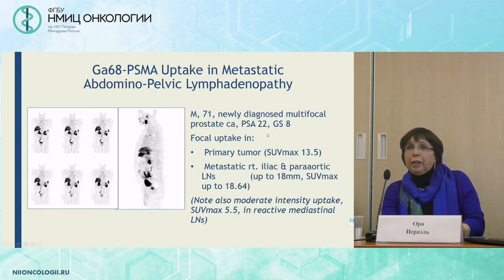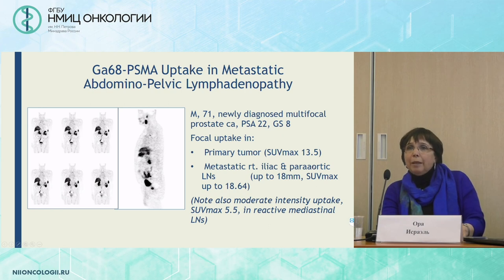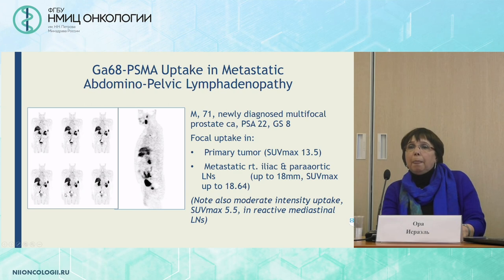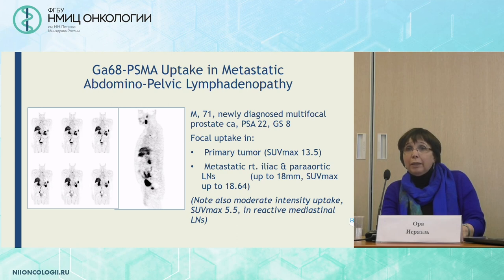Abdominal-pelvic lymphadenopathy can also occur, and we see it more and more since we do whole-body PSMA imaging. This is a patient at staging with PSA 22 and Gleason score 8. We see uptake in the primary tumor and also in metastatic lymph nodes up to 18 mm in size in the iliac and para-aortic region. Note also that we see uptake of lower intensity in the mediastinum, which we reported as reactive mediastinal lymph nodes.